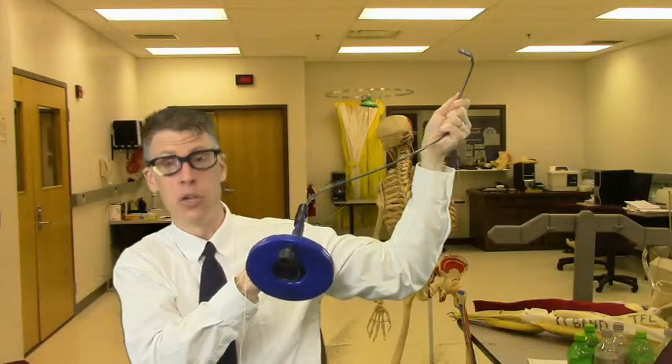A plumber snake is going to be necessary to clear this blockage, and we'll make the blockage. You can use a variety of things. What I do is I take a plastic baggie and some toothpaste, or you can use peanut butter. Both will be fine, and they will create a sufficient blockage that will challenge your students.